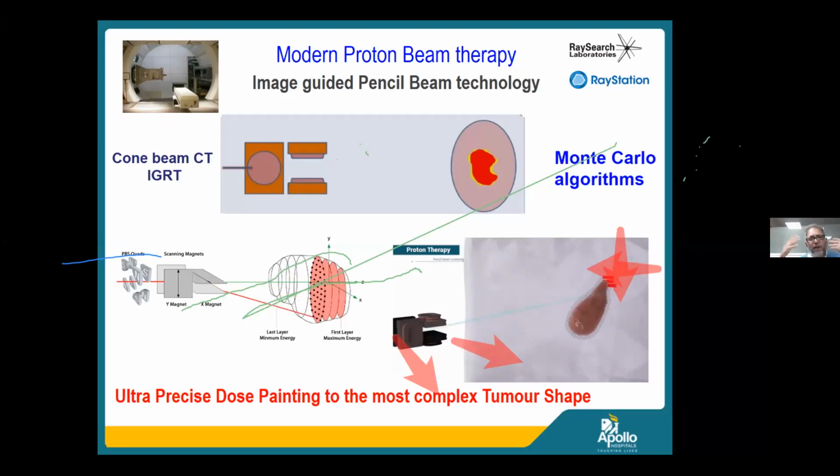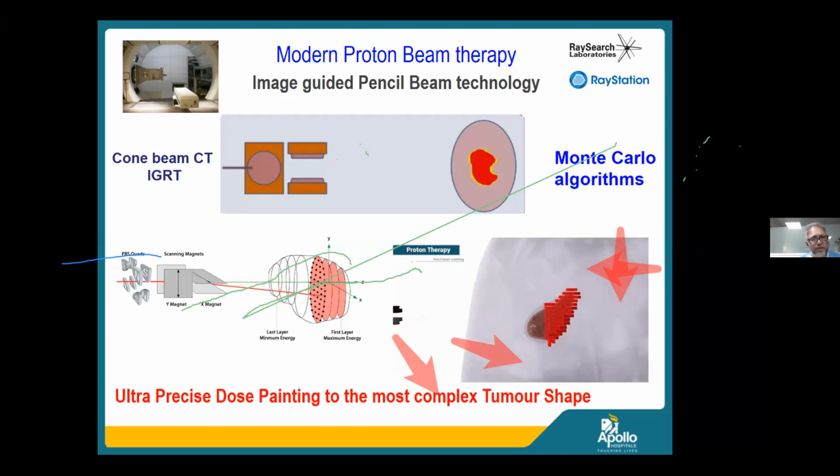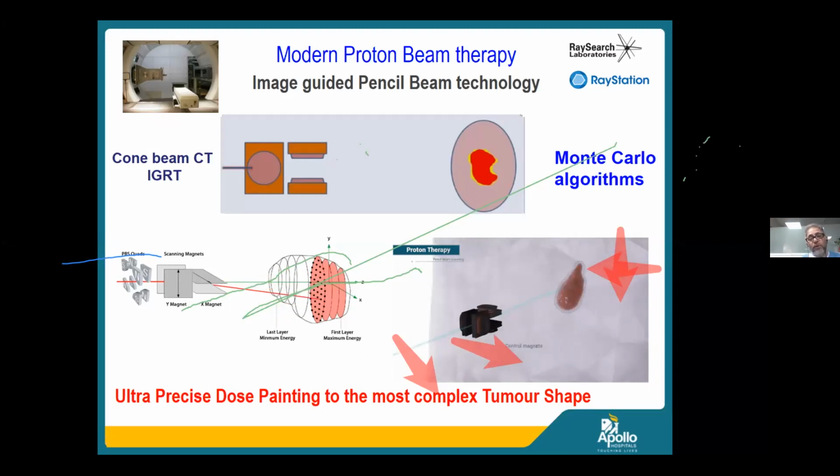It's an overwhelming sight. And I welcome many of you who are willing, and after this pandemic is over, when you're able to travel, you're more than welcome to visit our facility, and we will be delighted to show you how it works. And if you go at the back of the gantry, the gantry was not able to move. The couch was not robotic, it was not so accurate. So the modern proton beam has a very fantastic 6-degree rotation couch, which is very accurate.